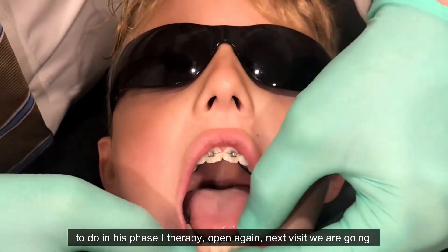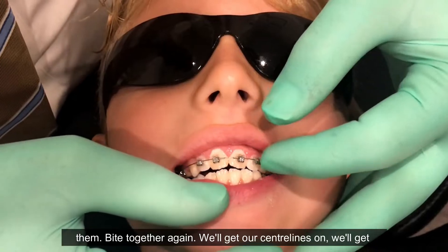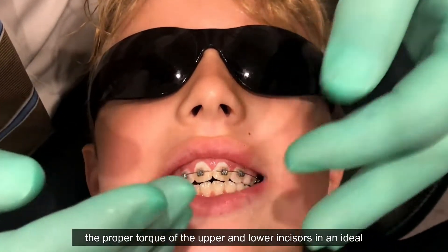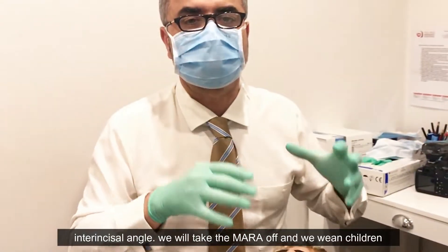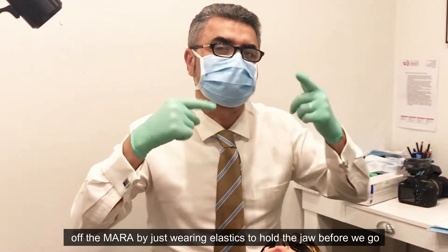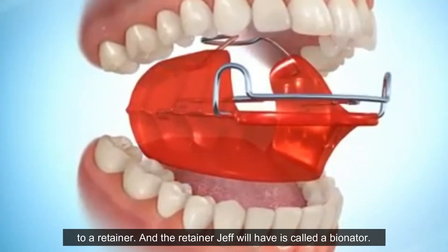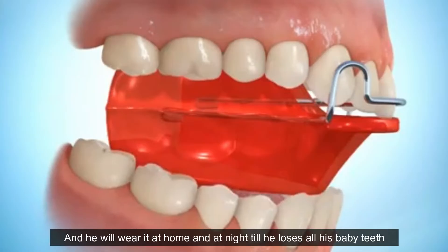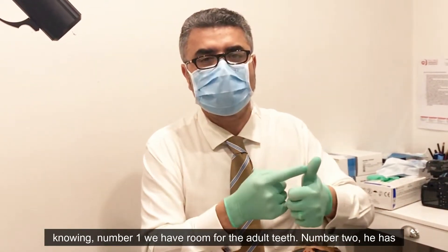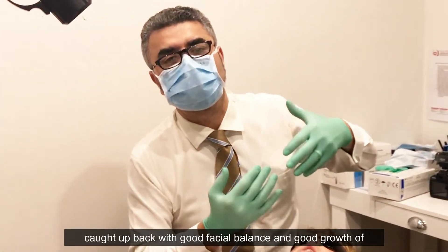What Jeff has left to do in his Phase 1 therapy: next visit we're going to put four brackets on the lower incisors to level and align them. We'll get our center lines, get the proper torque of the upper and lower incisors, and an ideal interincisor angle. We'll then take the MARA off — we wean children off the MARA by having them wear elastics to hold the jaw before going to a retainer. Jeff's retainer will be a bionator, which he'll wear at home and at night until he loses all his baby teeth, ensuring we have room for the adult teeth and good facial balance and jaw growth.